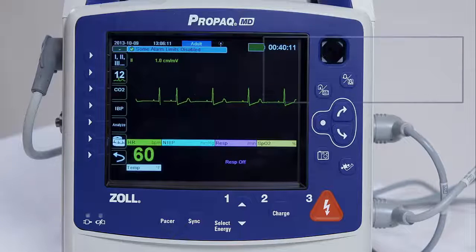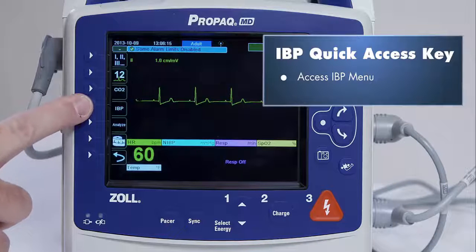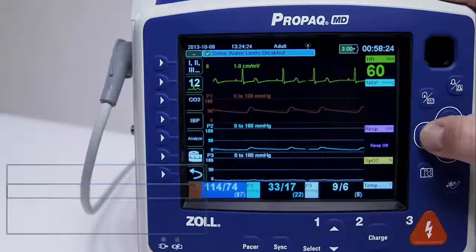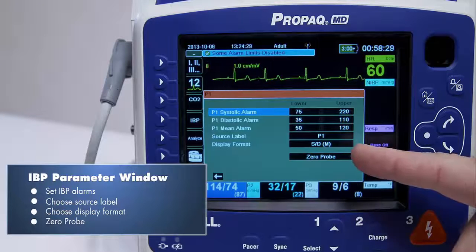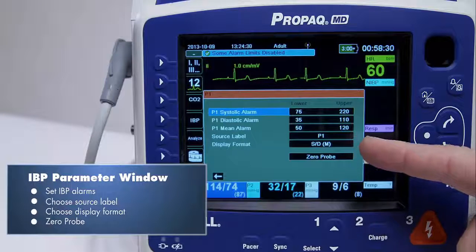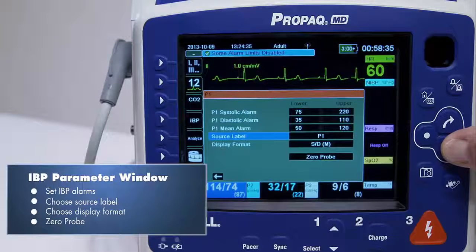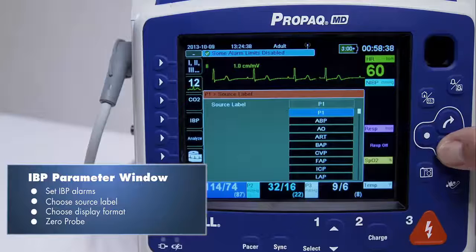The IBP Quick Access Key allows you to access the IBP menu in the critical care versions of the ProPakMD. Once in the menu, you have the options to set the IBP alarms, both upper and lower levels, as well as change the source label and display format. You can also zero the probe from this menu.